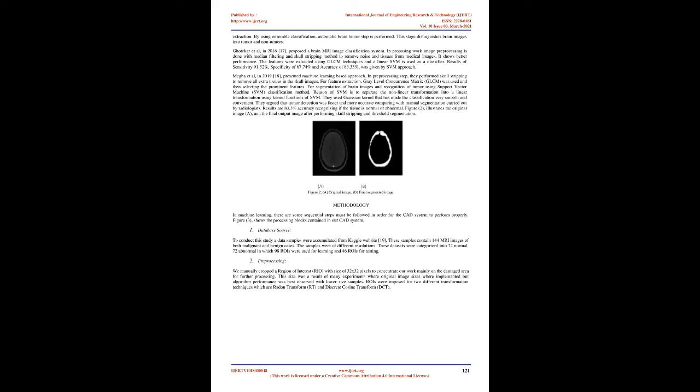John Peter, J., and Panachami, in 2019-11, developed an image fusion and CO-active adaptive neurofuzzy inference system, CANFIS, as a classification method for brain tumor detection and segmentation by combining with principal components analysis, PCA, and discrete wavelet transform, DWT.